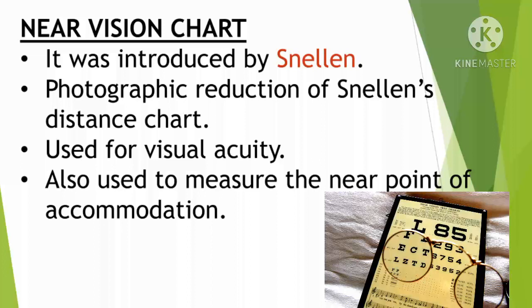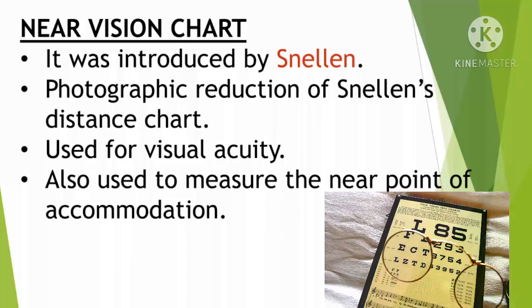The Near Vision chart was introduced by Snellen and is a reduced form of the Snellen chart. We use it to test near visual acuity, and also to measure the near point of accommodation.